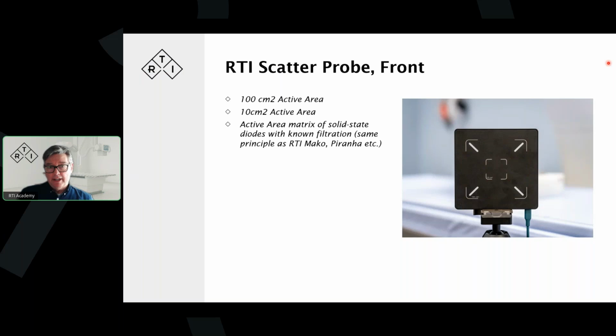Those active areas consist of a matrix of solid-state diodes, where we use the same technology and the same principles as the high-performance meters, Mako or Piranha or Cobia, where you have diodes in the active area with known, different filtration, calibrated to that area.